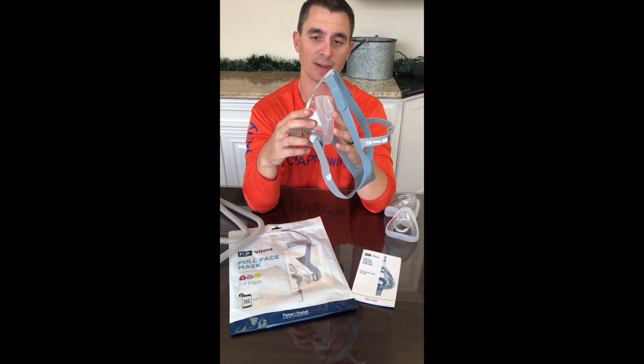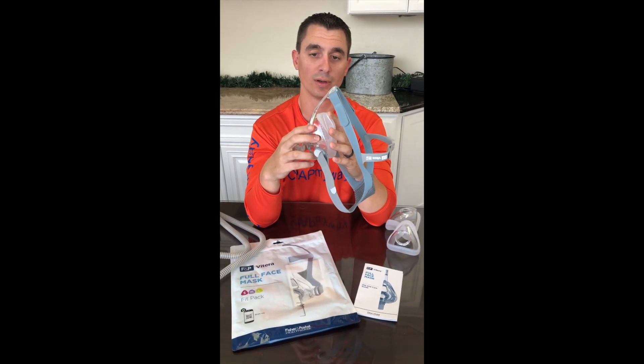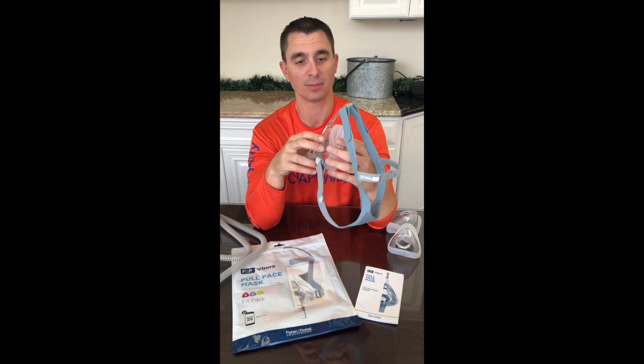And that roll fit design we talked about earlier is actually two times more roll fit on this mask than the predecessor, the Simplest.